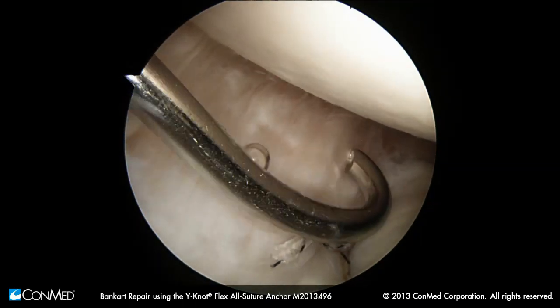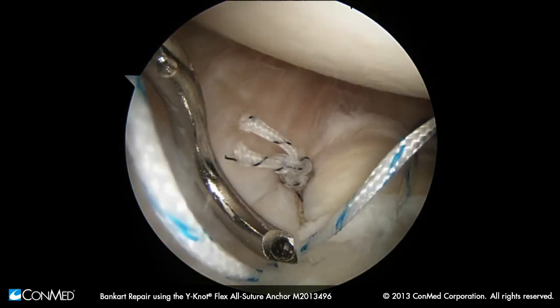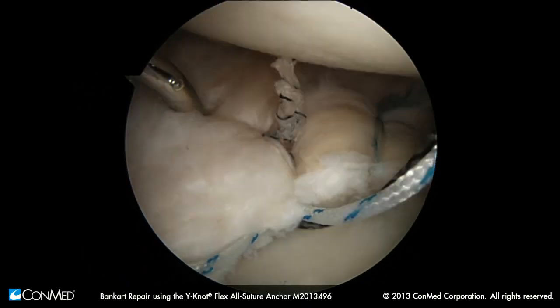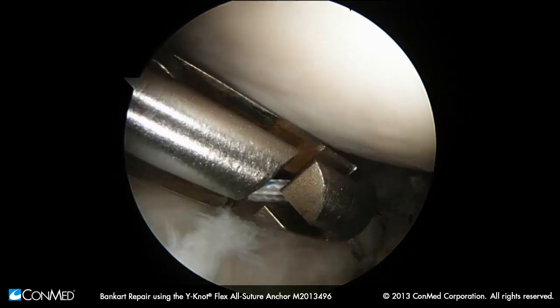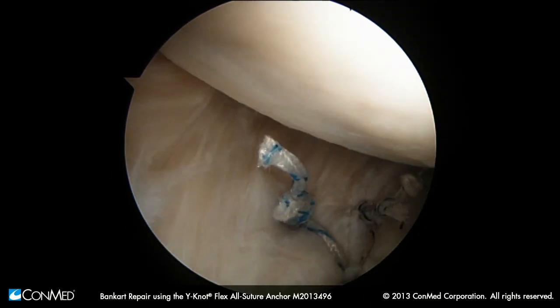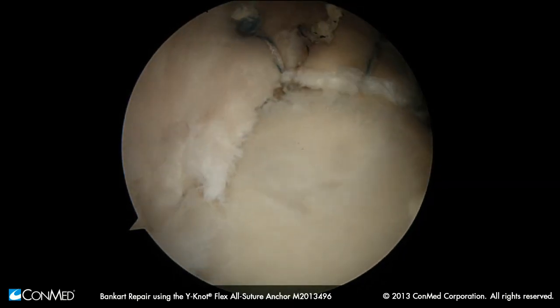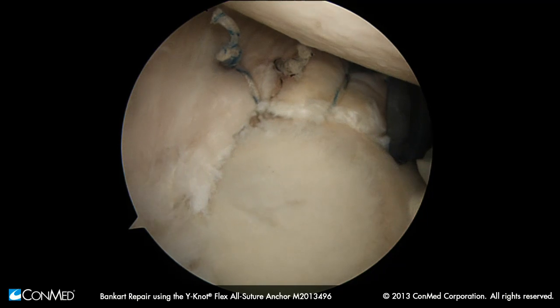This patient — I like the amount of tension I have right here. You can see it's pretty taut. In which case, I just want another pass — another point of fixation here. The first stitch is the one that advances it the most; subsequent stitches aren't going to do as much advancing. Down, through, and out. Then we'll tie this next one. You can certainly argue that moving your way up, you can bang in more singles on the way up. We'd probably put in at least two more anchors, if not three more, depending on the extent of the tear, working our way up every four or five millimeters or so.